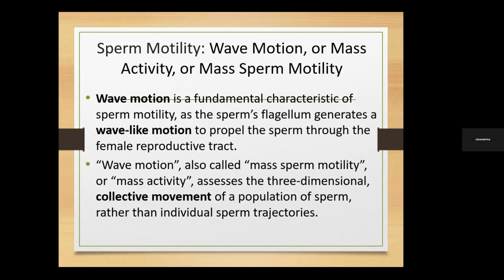It's different from total motility. When we get there, I will also explain that to you. But mass sperm motility is what is described as the wave motion, and it's a collective movement of a population of sperms rather than an individual sperm. Okay, right.